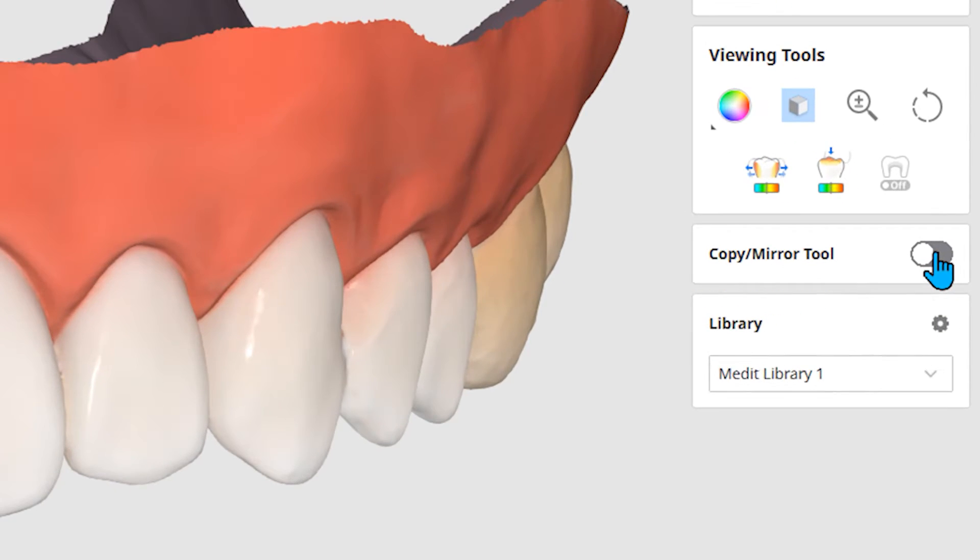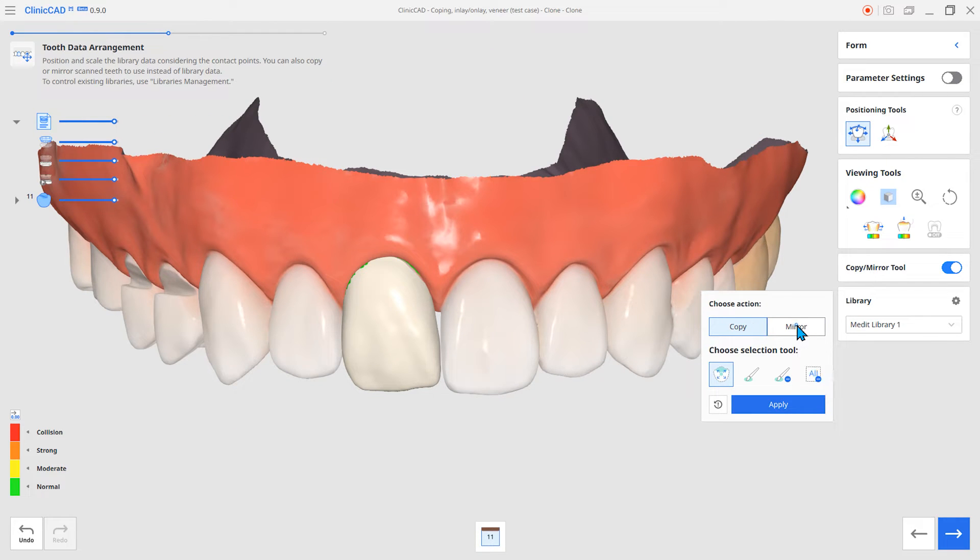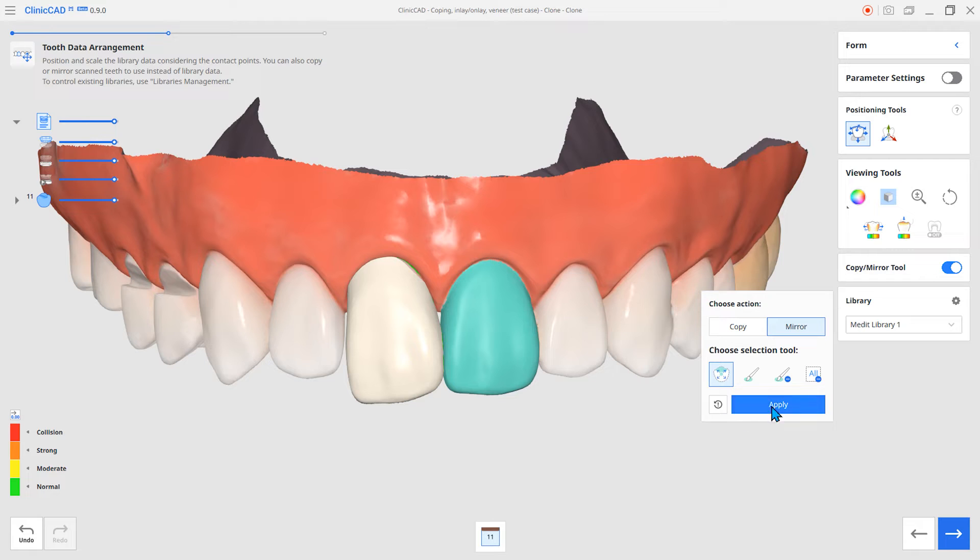The next feature is the Copy Mirror function. You can duplicate or mirror the adjacent teeth as a library.